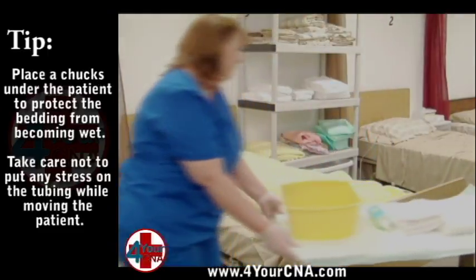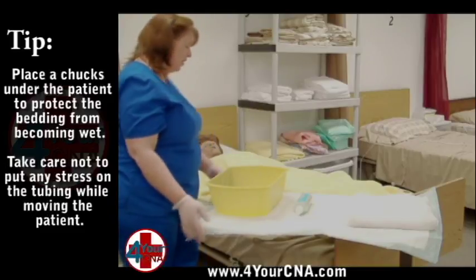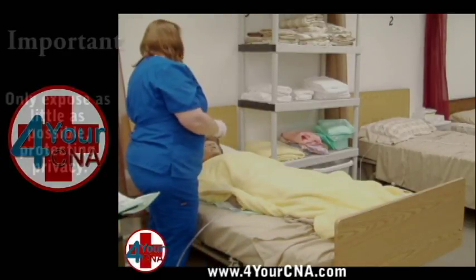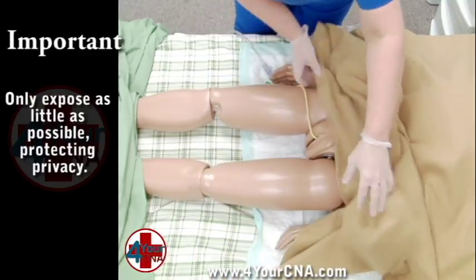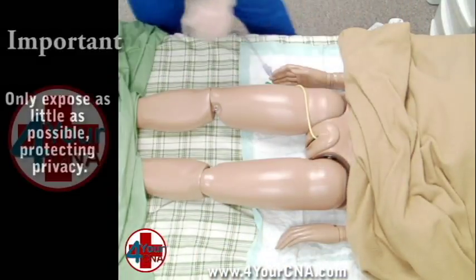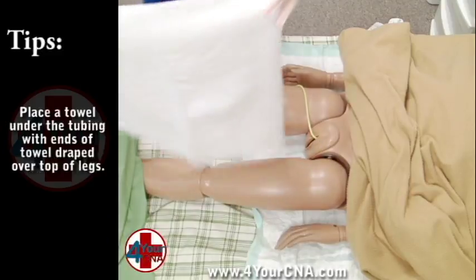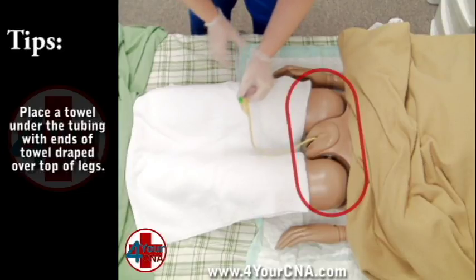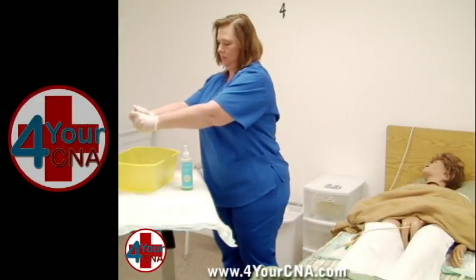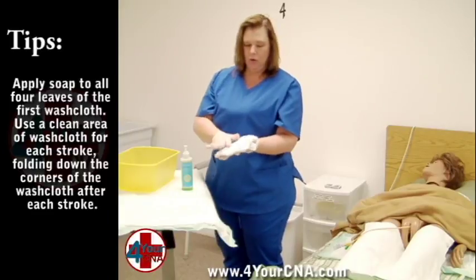Move the overbed table within easy reach and place all four washcloths into the basin to keep warm. Explain that you will be briefly exposing the patient. Roll the blanket up above the patient's waist, ensuring that the gown is encased in the blanket so that it will not get wet. Be careful not to pull on the catheter as you roll the blanket. Open the towel so it is folded in half and place over the patient's thighs to minimize exposure. The only area that should be exposed is the area where we are washing. Ring the first washcloth out and make sure it is folded into fourths. Hold it in your dominant hand with a folded corner at the heel of your hand and all four leaves pointing upward.